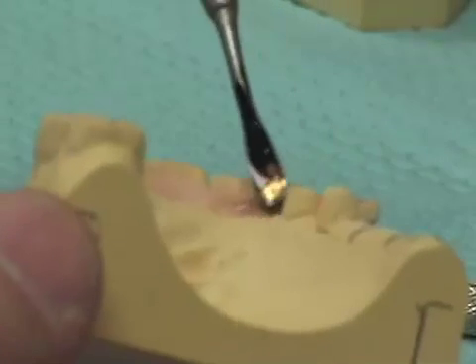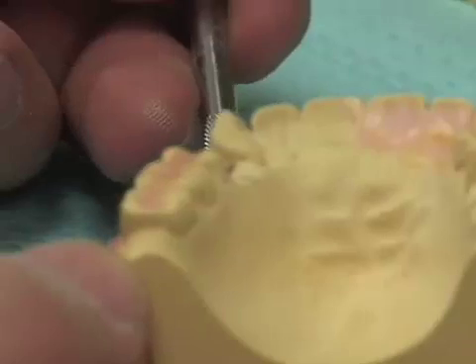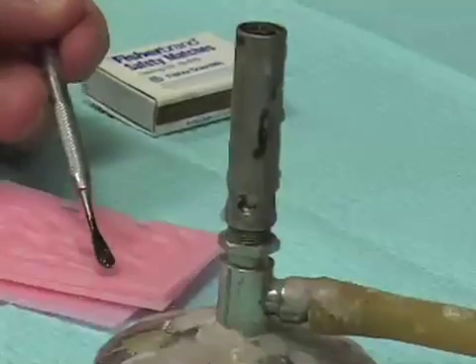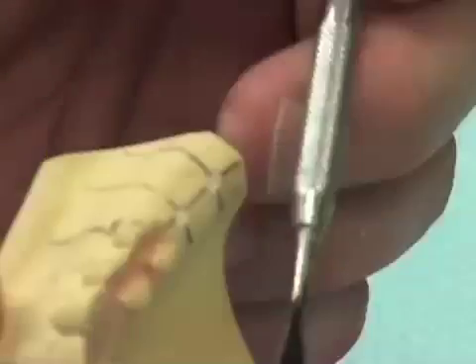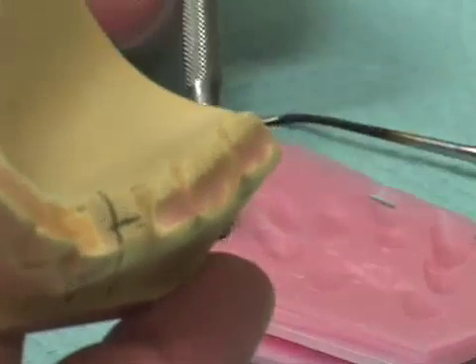I now proceed to the lingual aspect of the anterior teeth as well as the lingual aspect of the posterior teeth. Getting my wax spatula very hot, I flow a nice thin skin of pink baseplate wax across the lingual surfaces of the anterior teeth. When I come to the lingual surfaces of the posterior teeth, I want to flow the wax so that it fills in the depth of the indentation between the teeth. I'll then go across the arch to the opposite side and do the same thing, again wanting the wax to flow into the depth of the crevices between the teeth.